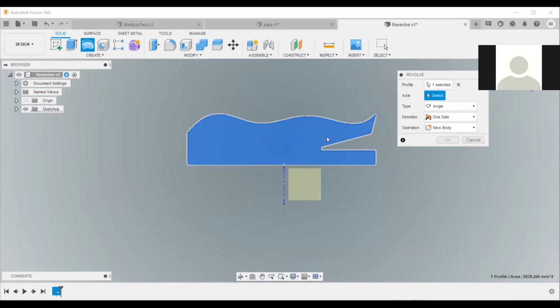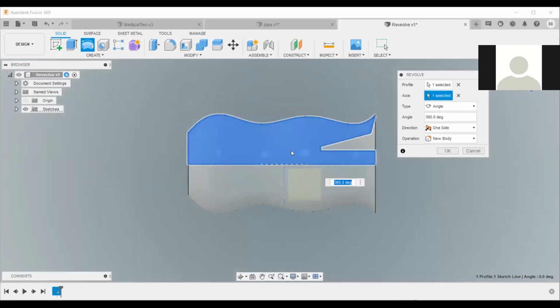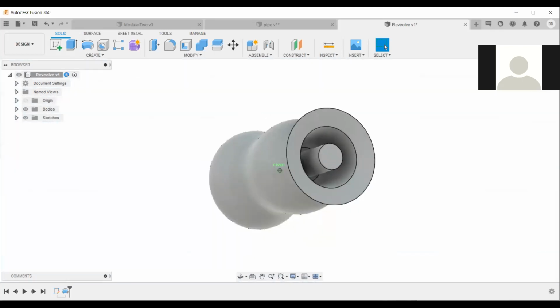Then you click on this part. You click on select profile. So you click on that. Then the axis, you click here below. Then you'll see how it is coming. You can even say how many degrees. So let's just do 360 for now. Then this is how it's going to look. And inside it, it's going to be hollow.